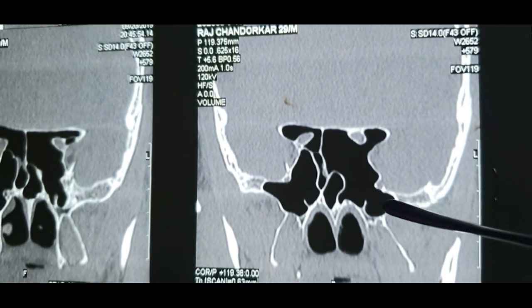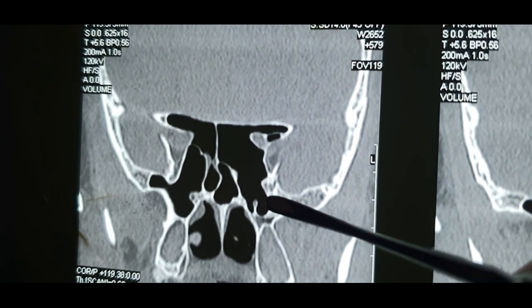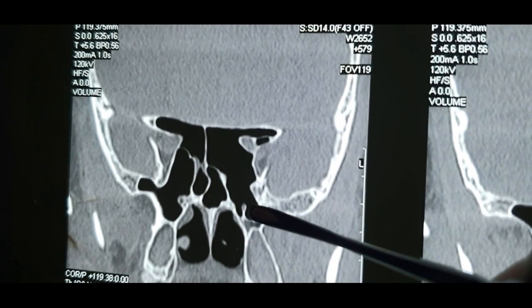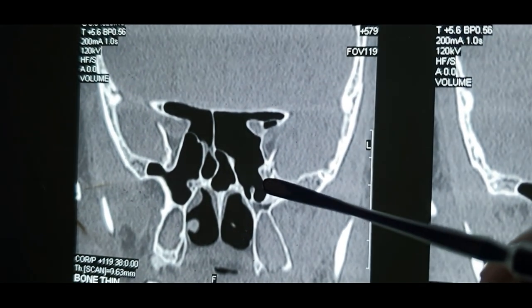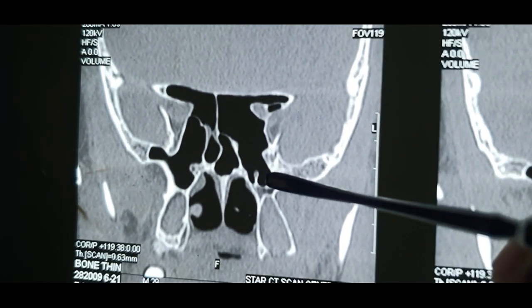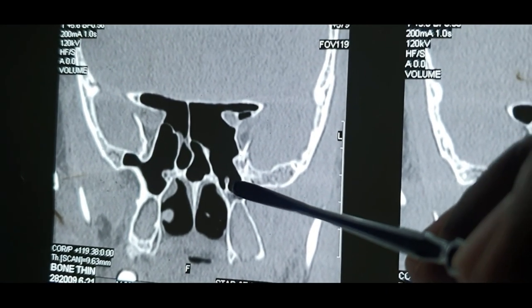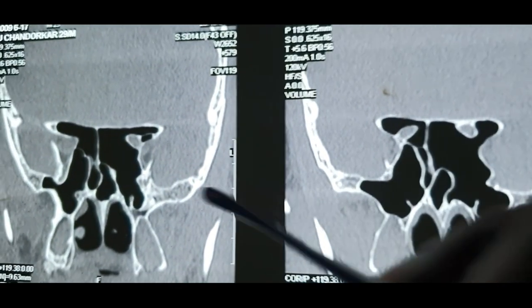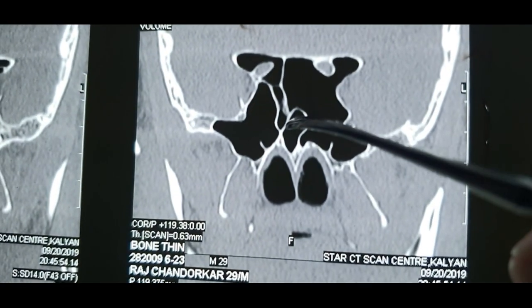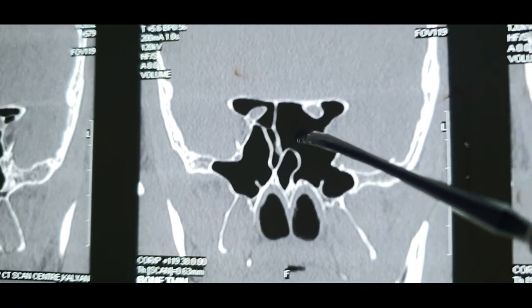We feel that is the medial pterygoid plate. Immediately above that is a pterygoid wedge. So this is a pterygoid wedge or the pterygoid body which has been pneumatized here. This is the area of origin of the juvenile nasopharyngeal angiofibroma. So until and unless you drill the bone and remove the JNA from the origin, that is the pterygoid wedge itself, the JNA will keep on recurring, lifelong or at least up to a particular specific age. You have to drill the bone and remove that. So you keep on going anteriorly, you keep on going posteriorly, you see the same structures coming.